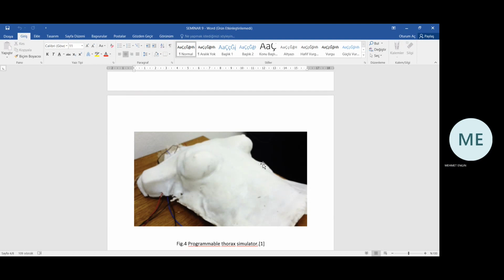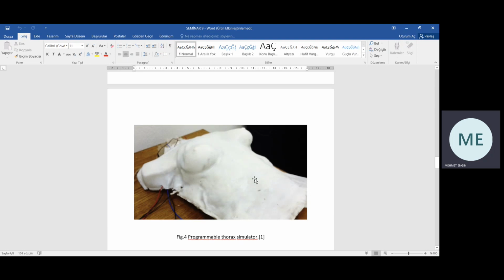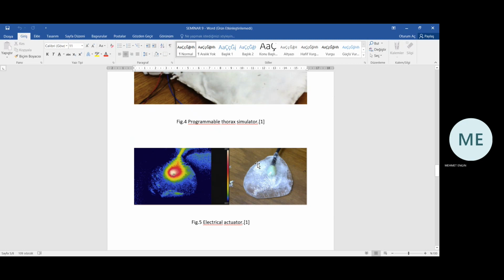These results, given in Figure 5, show that the thermal spots, associated with the heat release and the temperature gradient produced by the actuator, with an increase from 24.5 degrees Celsius to 28 degrees Celsius, were perceived. The hydrogel kept its consistency and mechanical properties, such as memory, tissue equivalent.